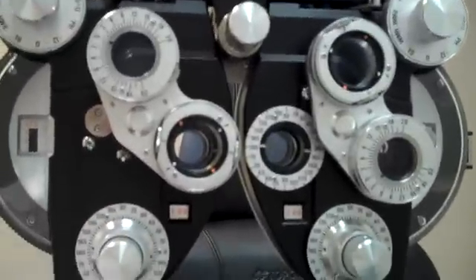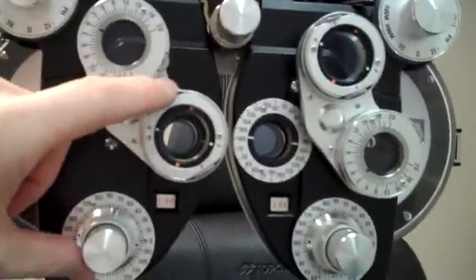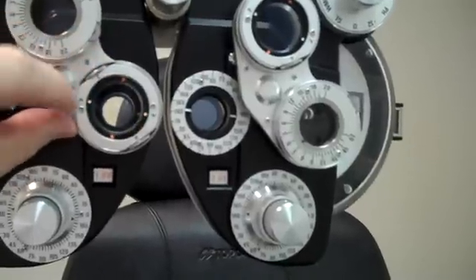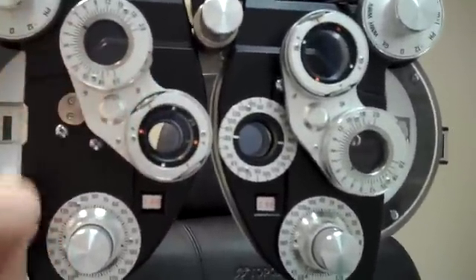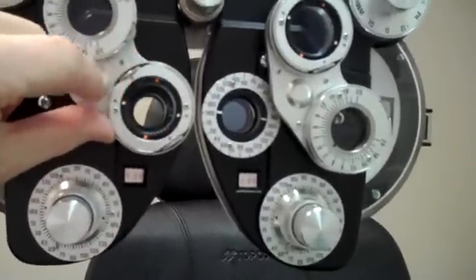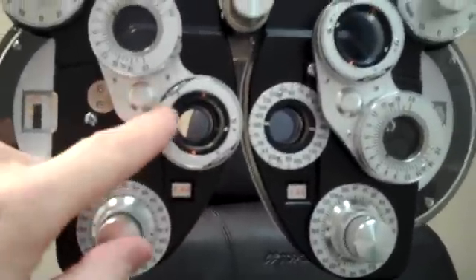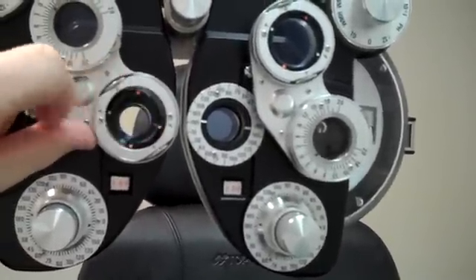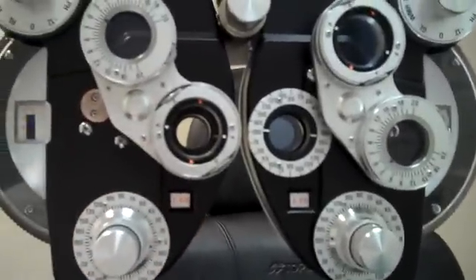Then I switch this to test how much astigmatism you have. Again, you've got the four dots. If this is number one, that's number two. See the red dot is here, white dot is here — that corresponds to the angle, right along the angle of your astigmatism. If the red dot is there, I'm going to give you a little bit more astigmatism power for that angle. Maybe one was better, so you've got the white dot — it's going to be a little bit less. You go one, two, one, two — which one looks better? And you say they're both the same. That's actually good. That means this power, this one unit, is exactly what you need.